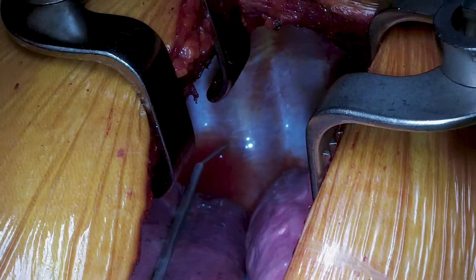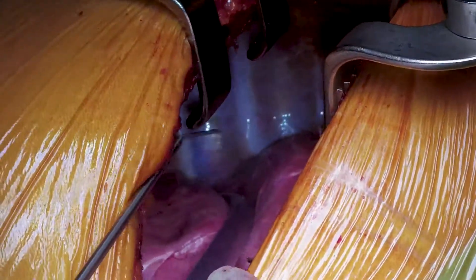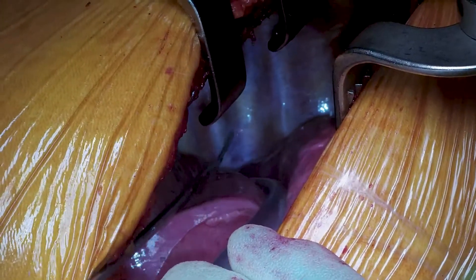What Mr. Dunning is doing here is injecting 10ml of local anaesthetic into each intercostal space to give an intercostal block from ribs 1-12. He started lower down because the lung cancer had a bit of adhesion at the top which he removes later on. This solution is made up of 60ml of bupivacaine at 0.25% with adrenaline, 10ml of bicarb to help with acidity, and 60ml of saline.